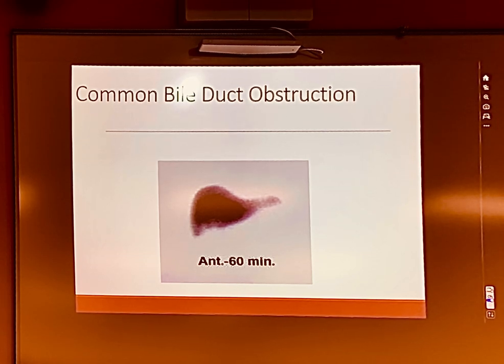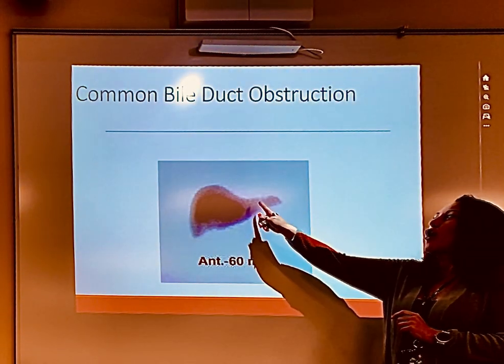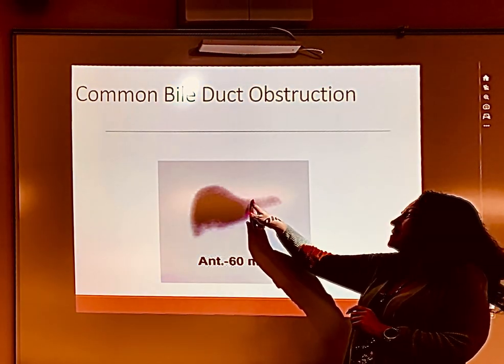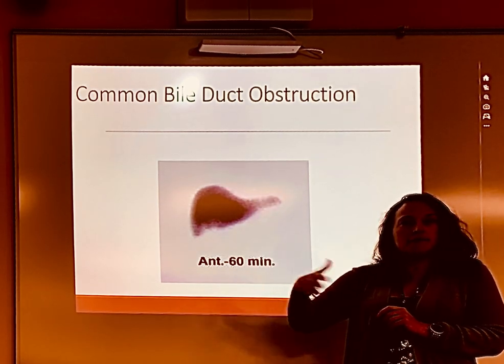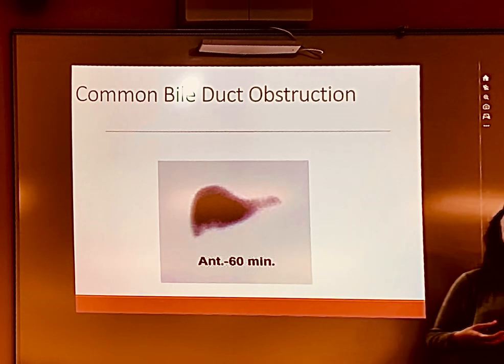But not severe hepatocellular dysfunction, because if he had severe hepatocellular dysfunction, we'd have heart right here. We would still have cardiac activity because it would still be floating around in the blood, because it wouldn't pull it into the liver.